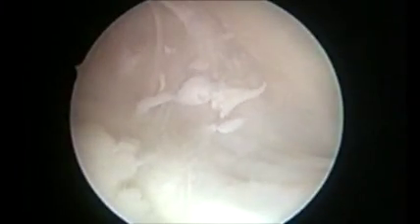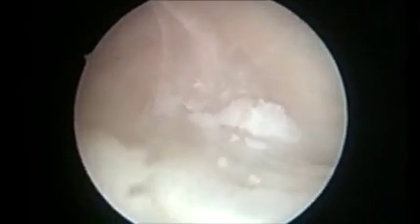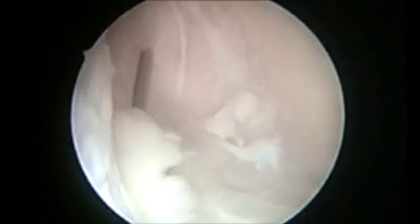The posterior middle compartment is entered through the interval between the PCL and the medial femoral condyle, and again the synovial folds are identified.